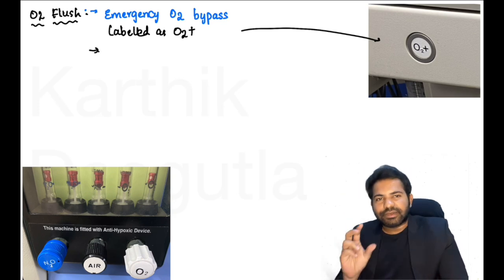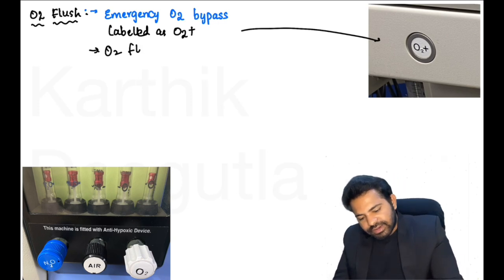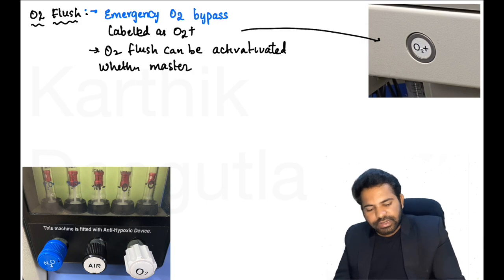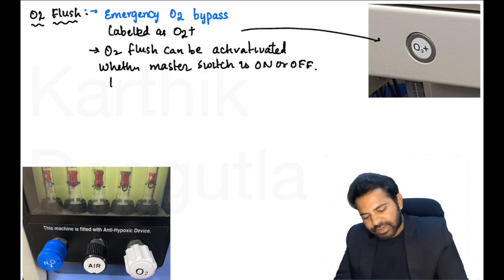Irrespective of whether the master switch of the anesthesia machine is on or off, the oxygen flush can be activated. Clear?